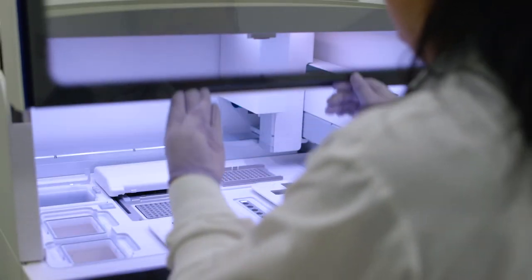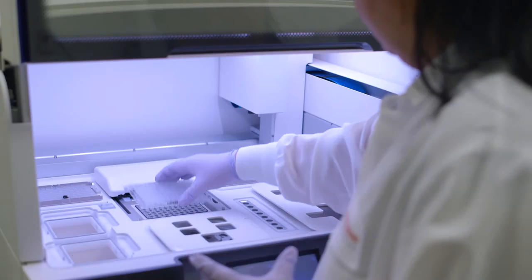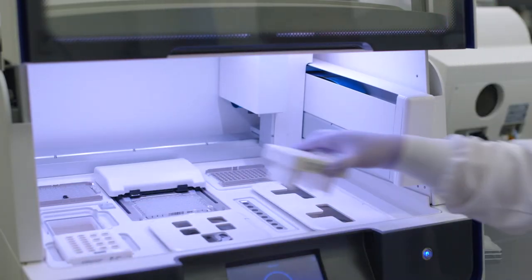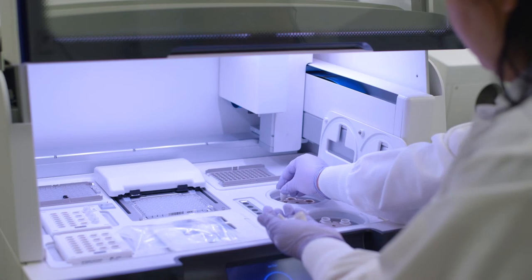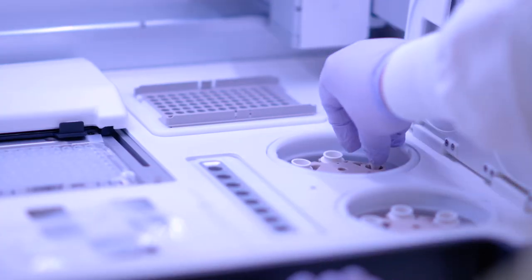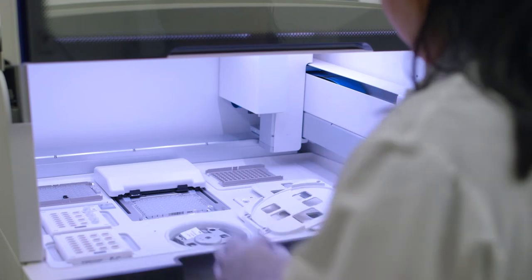Setting up template preparation and chip loading is very simple as they both occur within the same ION-Chef workflow. First, you just have to snap everything in. The tip rack goes here, and then the PCR plate gets placed within the thermocycler and a new frame seal is added. The reagent cartridge is placed on the deck and the Single-Seq library sample tube containing 50 microliters of diluted library is loaded into position A. Lastly, we include recovery tubes in the recovery station, the enrichment cartridge, and a single chip within the chip loading centrifuge, and a chip balance in the second position.